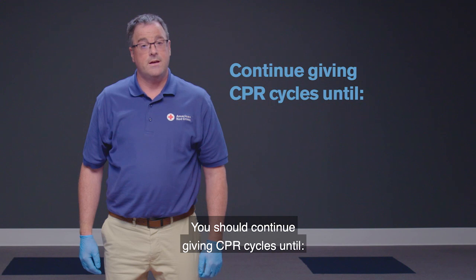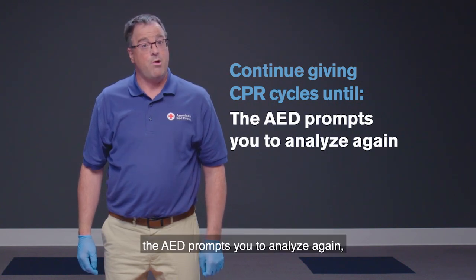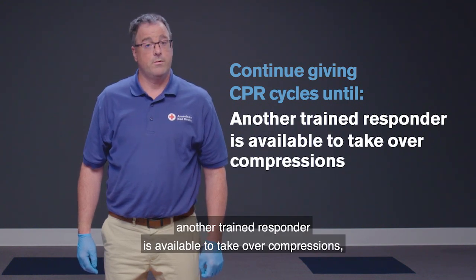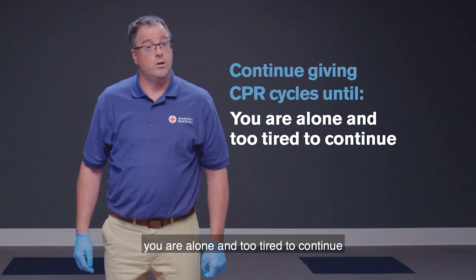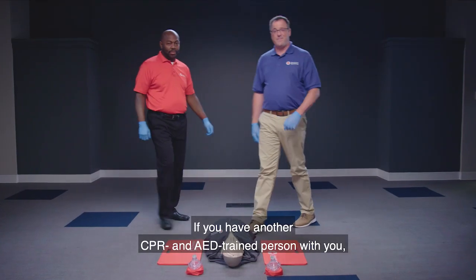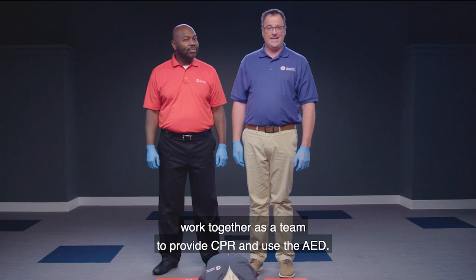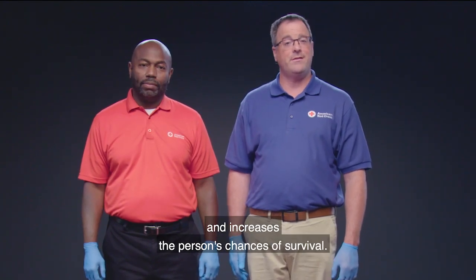Continue giving CPR cycles until you notice an obvious sign of life like breathing, the AED prompts you to analyze again, another trained responder is available to take over compressions, or EMS personnel arrive. If you have another CPR and AED trained person with you, work together as a team to provide CPR and use the AED. This teamwork minimizes interruptions to CPR and increases the person's chances of survival.